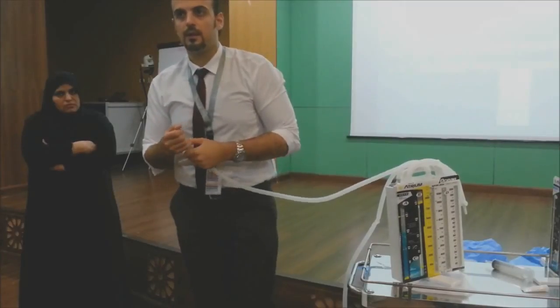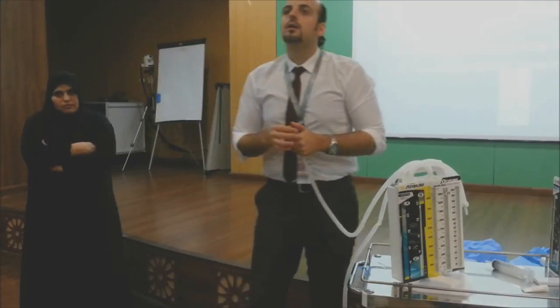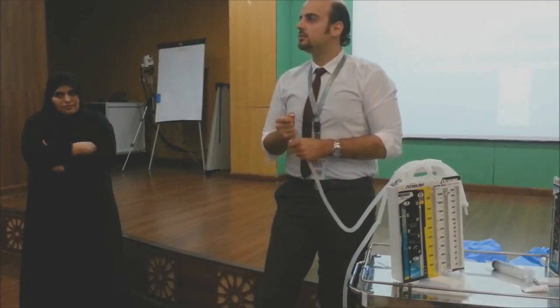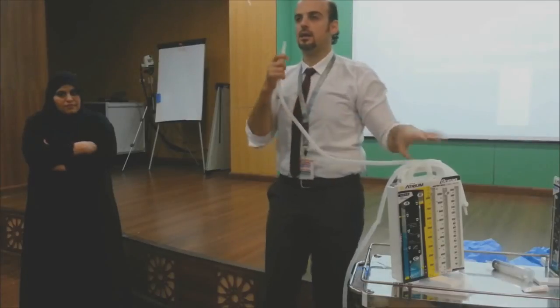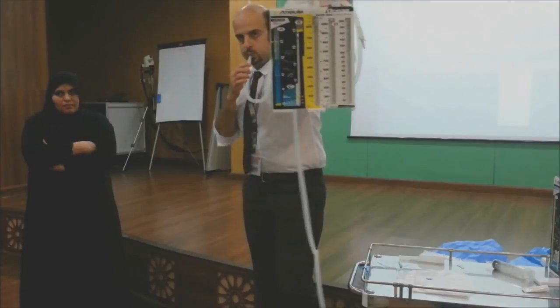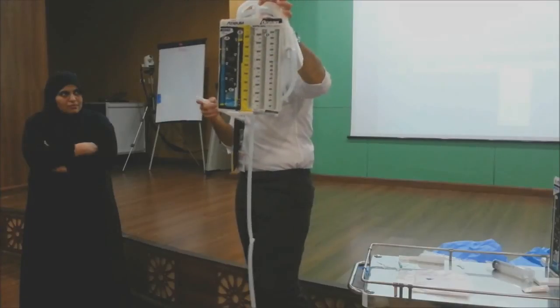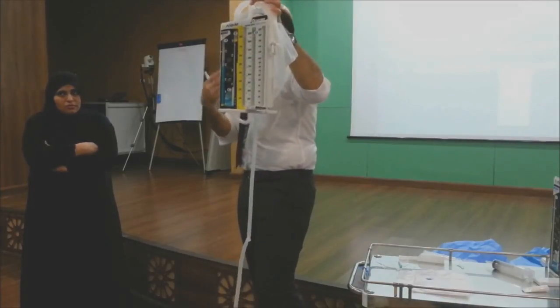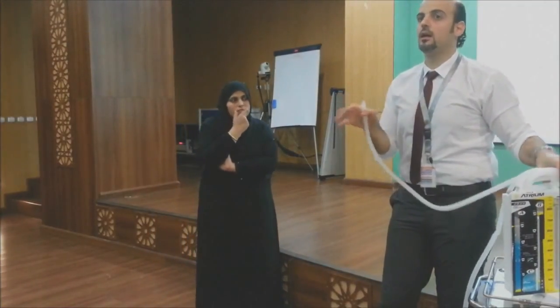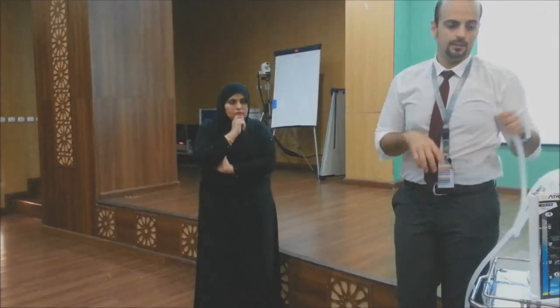Is there any condition in which we cannot clamp the tube? I said it now. If the patient is like this, guys, can you imagine you can clamp this? All this air coming outside the patient, if I clamp it, it will collect again into the chest. So nobody is allowed to clamp in this situation.